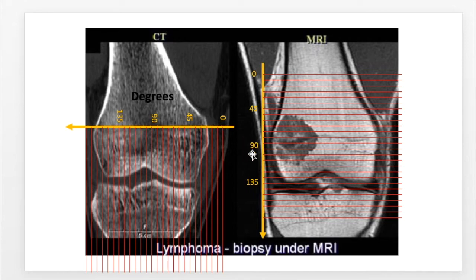Furthermore, you can use a straight radial system, as I did for the normal colon and the serrated colon, and that baseline coordinate system can be arbitrarily placed too. Again, it depends on what you're trying to measure, and whether it makes sense. In this case, on the right, we're measuring the contour of this tumor, starting from the left side as the base.